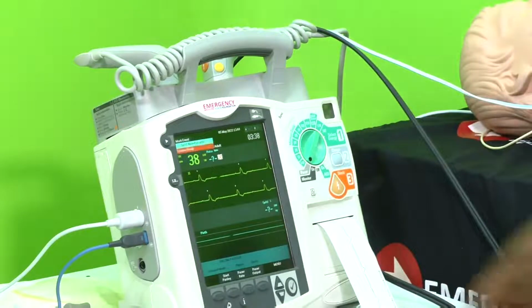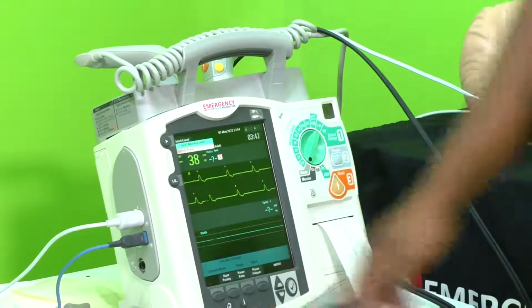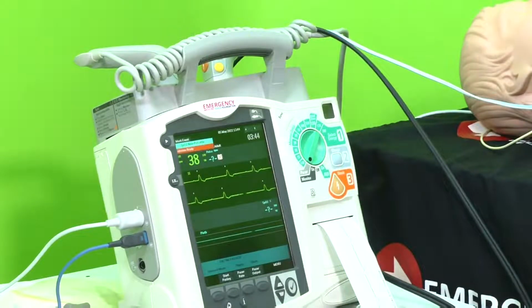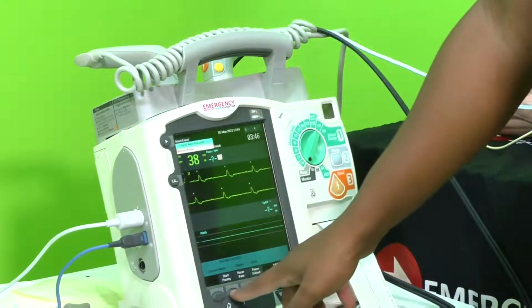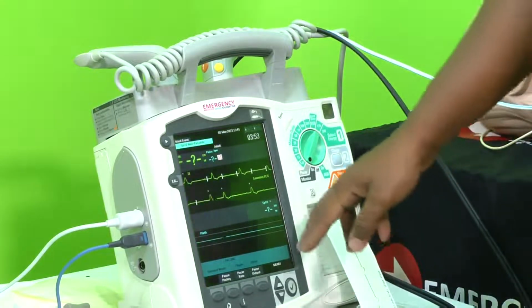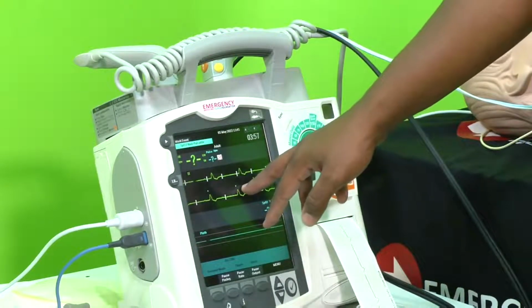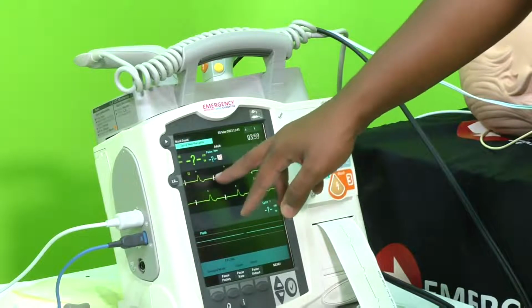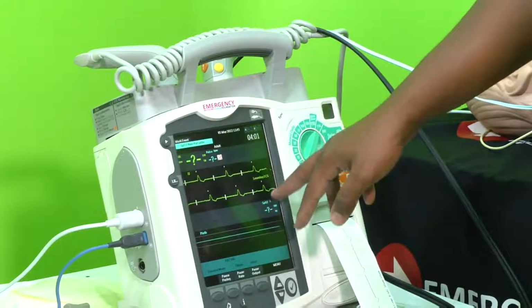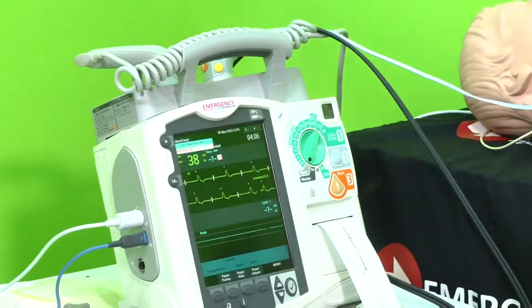I can see pausing, paused, and the first thing it says is start pacing. So I will start pacing. All right. So the moment I started pacing, I noticed something. You can note we have the markers on the R-wave that were there also with cardioversion, but now we actually have pacing spikes. So these pacing spikes are essentially the machine sending electrical activity to the heart.